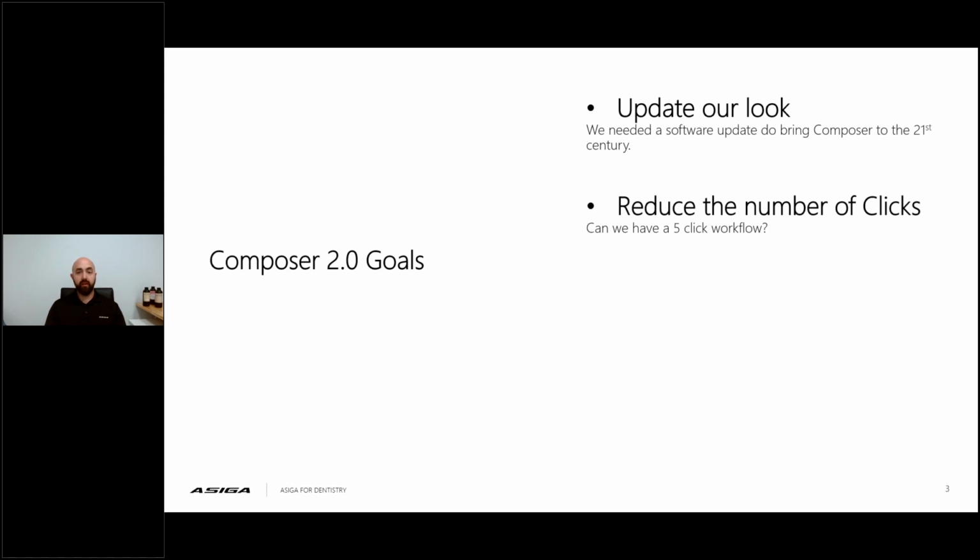We also want to reduce the number of clicks to get through the workflow. Can we get to a 5-click workflow? I think when we look at software, we really want to achieve a workflow in 1 click, right? I mean, I think that would be pretty amazing to be able to have a 1-click nesting software for a 3D printer. And maybe that's something of the future. Maybe that's something we'll have in the future. But as of right now, we wanted to reduce the intimidation and the number of steps needed to be able to process a print job from start to finish.